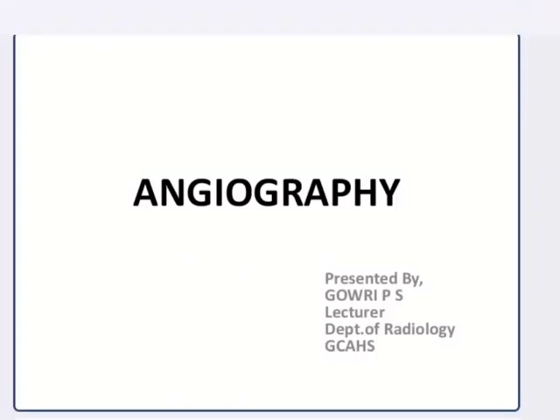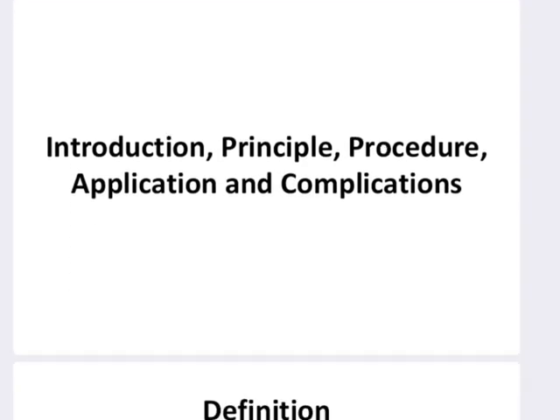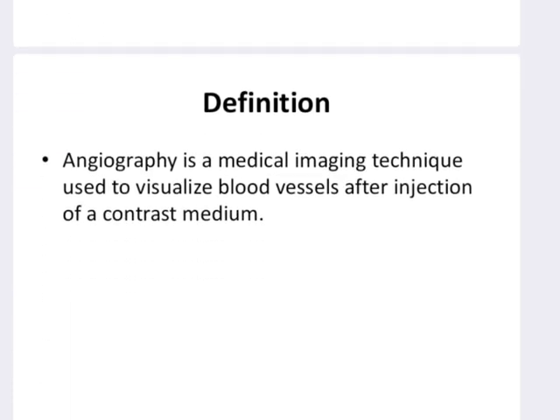Today we are going to discuss the topic angiography. First we will be dealing with introduction, principles, procedure, application and complications. First, we look at the definition. What is angiography? Angiography is a medical imaging technique that is used to visualize blood vessels after injection of a contrast medium.